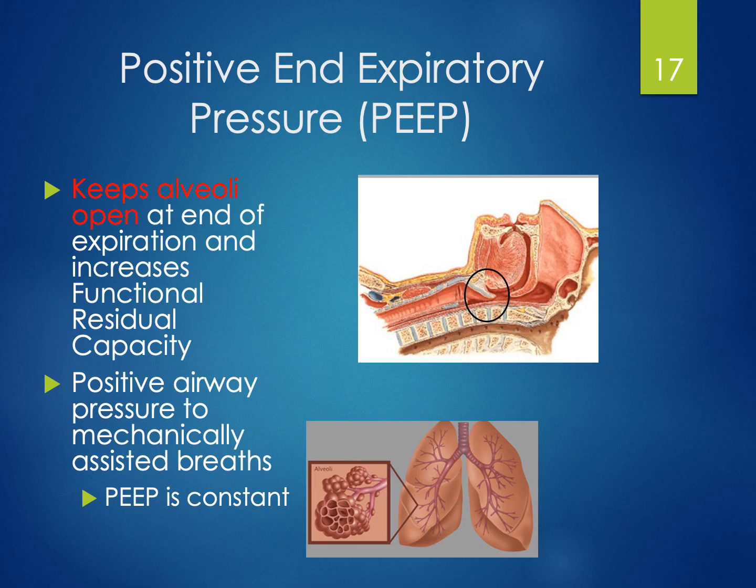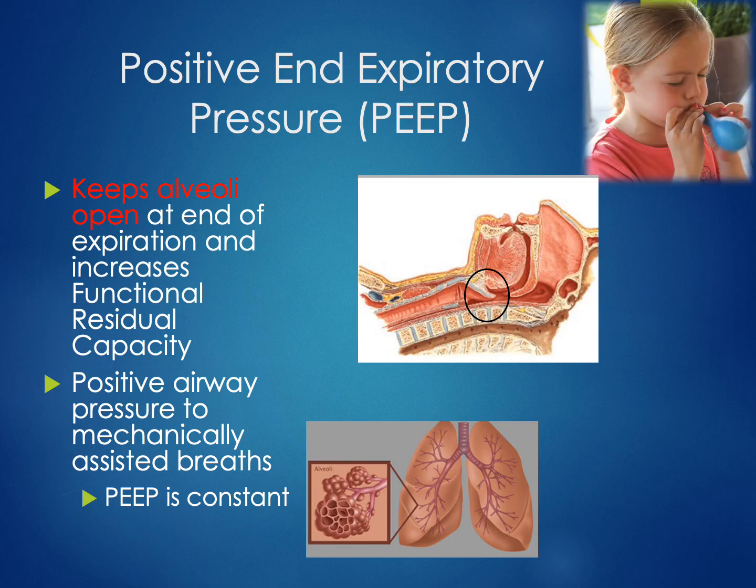Now, why is this a good thing? Well, if we did fully empty our lungs on every breath we exhaled, then we would have to re-inflate our lungs with every inhale. And this is hard. Think about having to blow up a completely empty balloon over and over and over. Your cheeks would get really tired. It's really hard. But what if there was just a little bit of air that was keeping the balloon inflated?